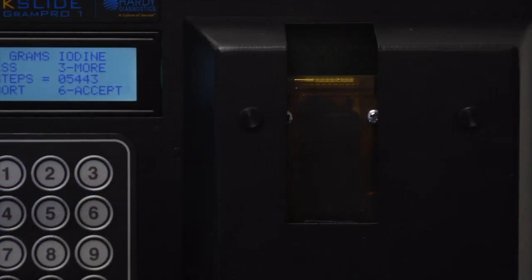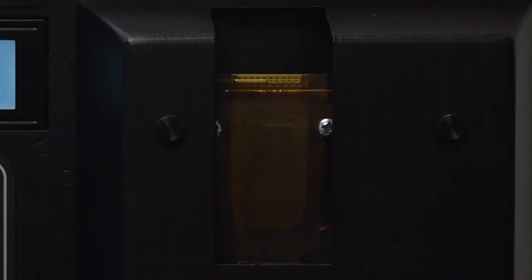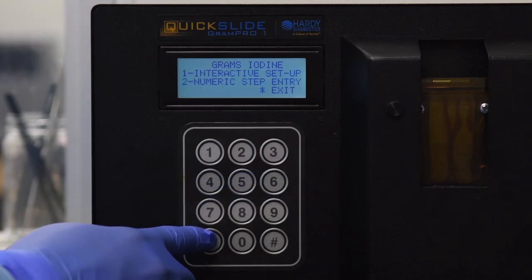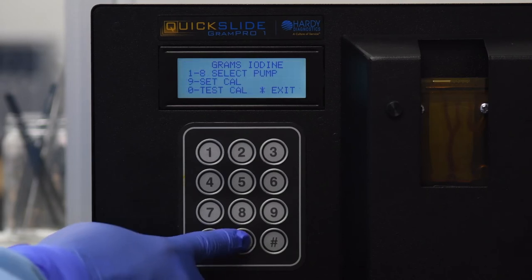Press and hold 3 until you begin to see grams iodine filling the cuvette. If you accidentally fill the cuvette too much, press 1 to select Less until the cuvette drains almost completely — a little fluid in the cuvette is OK. Press 6 to select Accept.